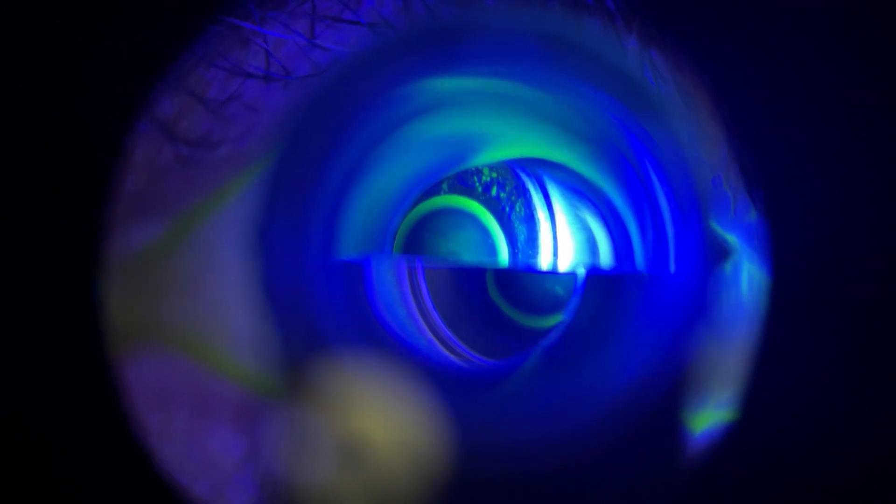Another problem I've already mentioned: if you're using your fingers or a Q-tip to open the patient's eye, you can apply pressure on the globe. This usually shows itself as a very volatile measurement that changes every time you put the measurement head on the eye. If this is happening, try to lift up the lid without putting pressure on the eyeball. Another very common issue is too many tears — if your semi-circles are too thick, your measurement is going to be wrong, so dry off the patient's eye and measure again.